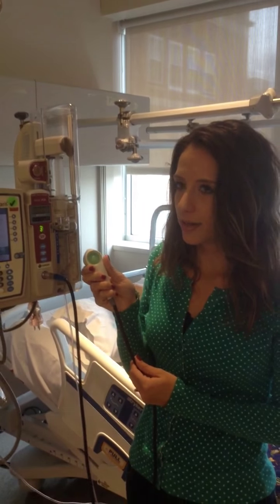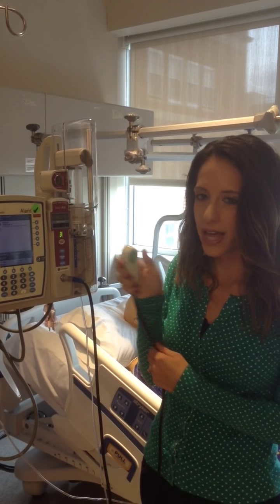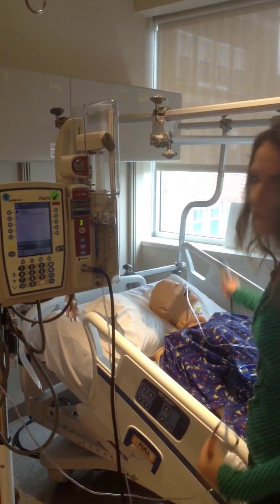The patient will hold this in their hand, and when they feel that they need pain medication or that they're not feeling well, they can press this button and it will be infused through their IV or their PICC or their port to properly manage their pain. So we'll give this back to our patient.